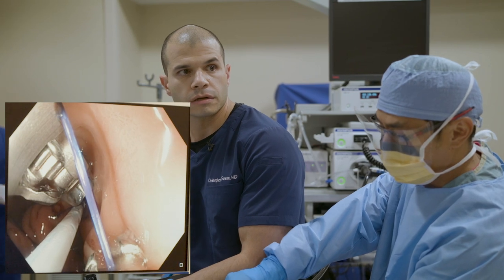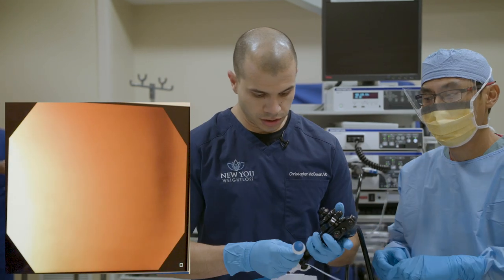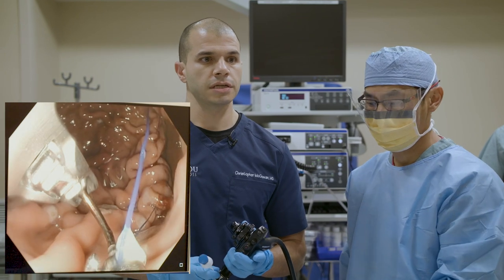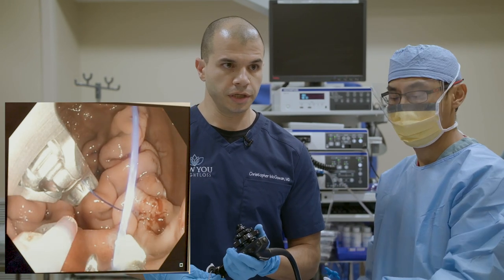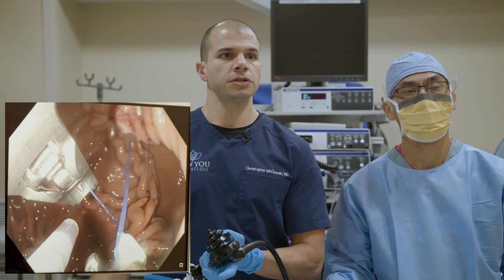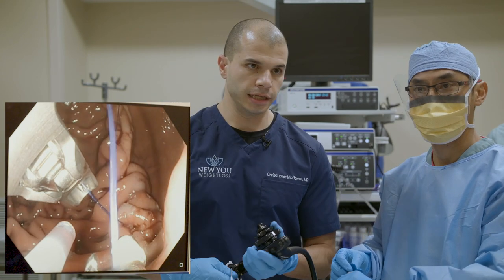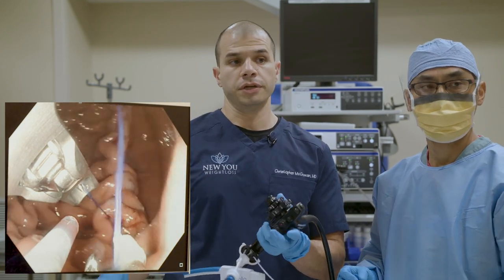The recovery from this procedure is drastically shorter than any surgical sleeve. Most patients are back to work in two to three days, and may feel a bit tired in the first week, but major side effects have completely resolved. We generally have our patients back to light exercise within seven days after the procedure, and they can start more vigorous exercise generally within two weeks. What we've done here is suture from the front wall to the back wall, making a U-shape — coming down, across the bottom, and back up — then tightening.